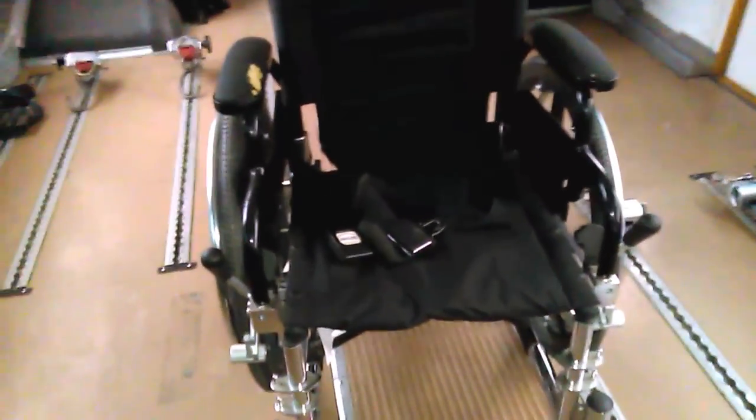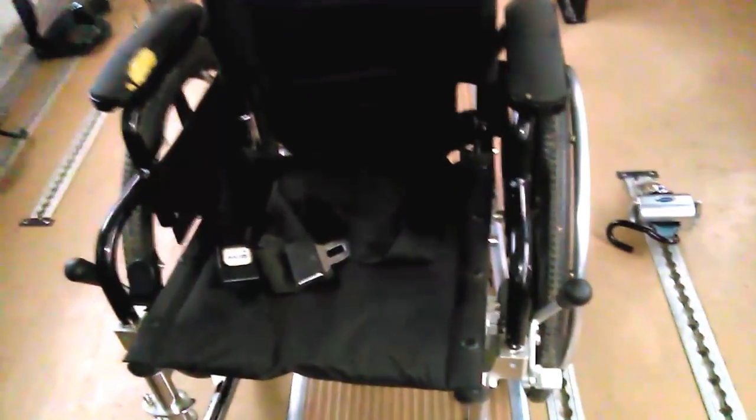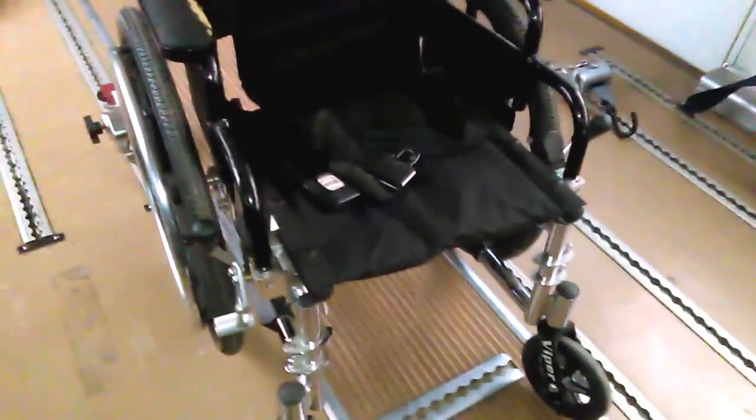That is very important. The district that I work for has a policy that if any of those items I just checked are not properly maintained, we can refuse transportation, because that's an extra liability on the driver.